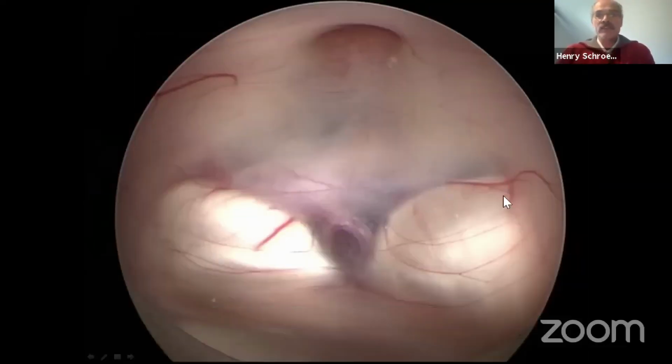Another patient, mammillary bodies, and you see this is very important. These are perforators. The perforators always go from the basilar bifurcation in a posterior direction. So even though this is the thinnest part of the floor, never do an ETV here, because when you inflate the balloon, you might rupture one of these perforators and can have a severe subarachnoid hemorrhage. Perforation should always be in front of the basilar artery, and this is the infundibular recess.